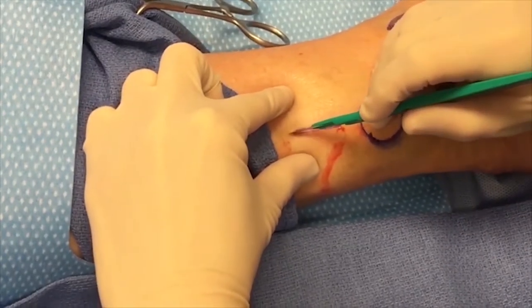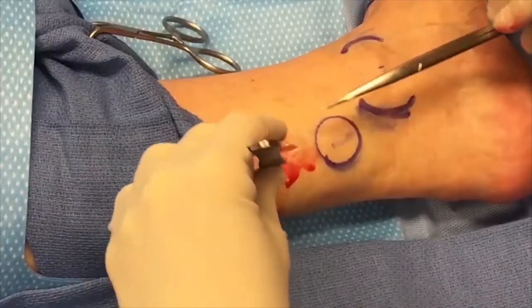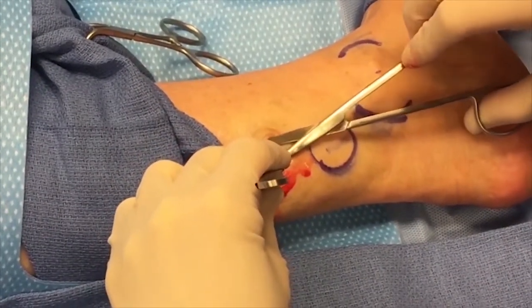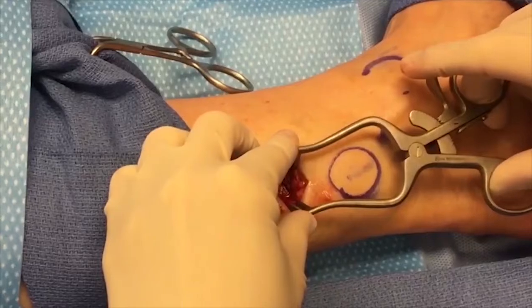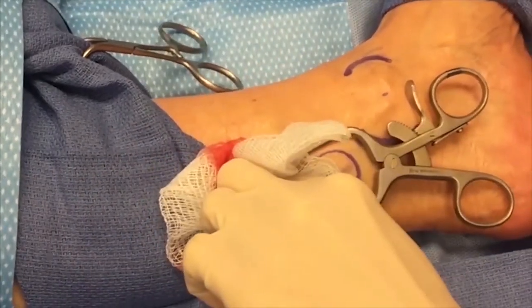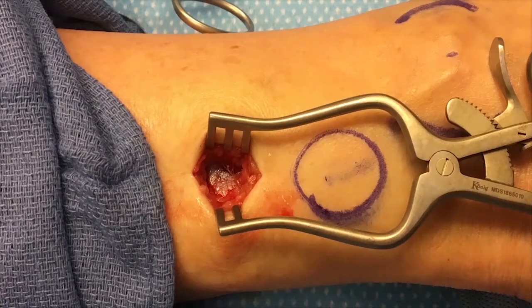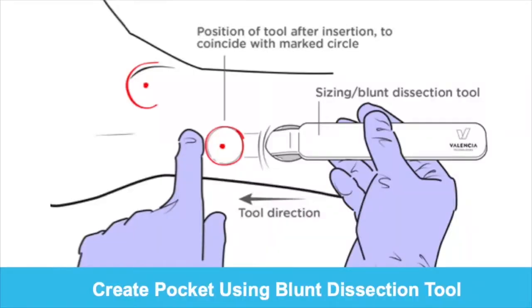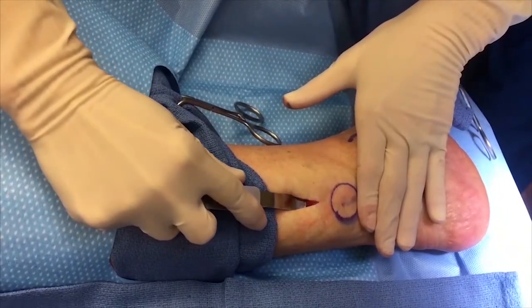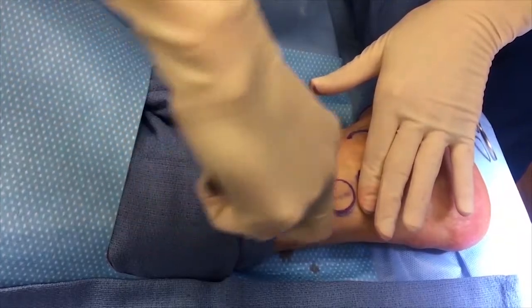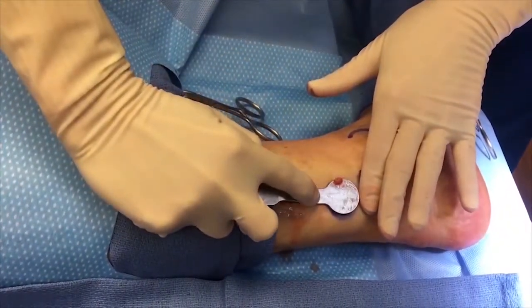Step 5: Make Incision and Create Device Pocket. With a scalpel, make an incision on the marked longitudinal line. Using dissecting scissors, bluntly separate the subcutaneous fat layer and identify the plane between the subcutaneous fat and the fascia. A self-retaining retractor helps visualization while performing the blunt dissection. Once the fat is cleared, the fascia will be visible — it appears as a white layer with transverse fibers. The blunt dissection tool was developed to simplify pocket creation. Gently and firmly push the tool until its rounded end coincides with the marked circle on the overlying skin.